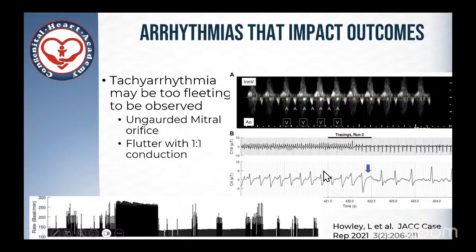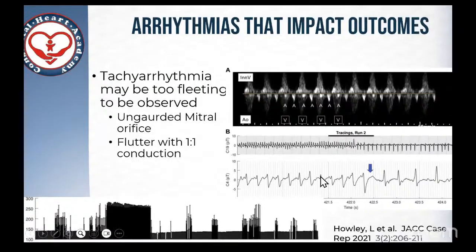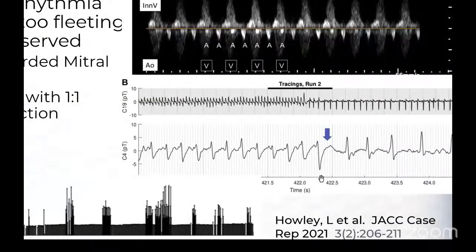Janet, can you just make it easy and explain the diagram? Where's the ST, where's the PR, and so on?